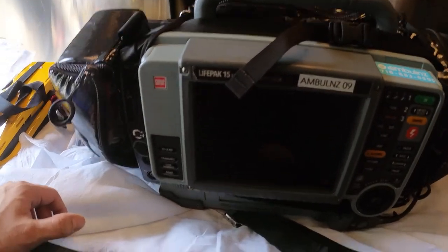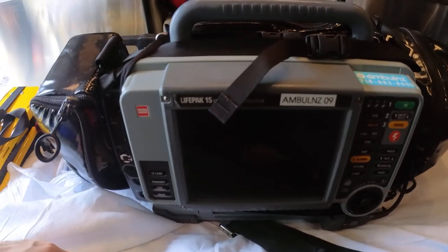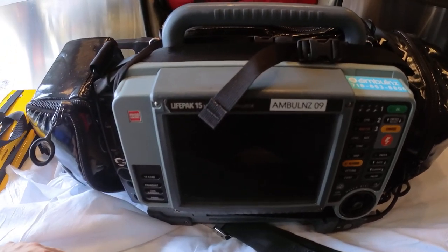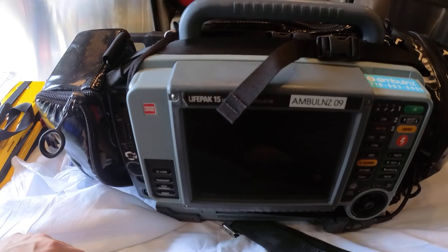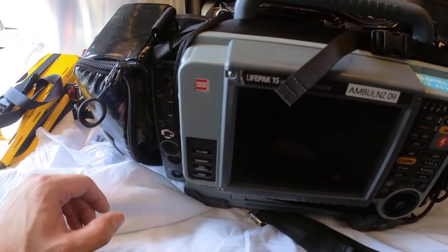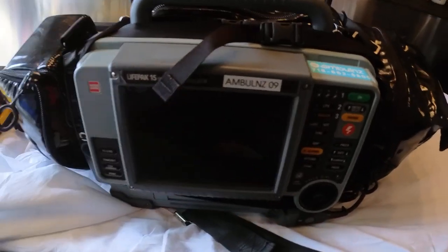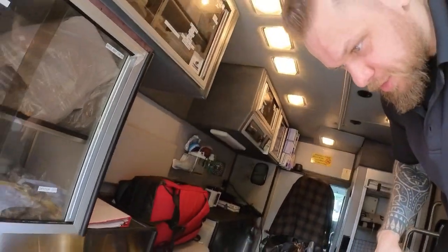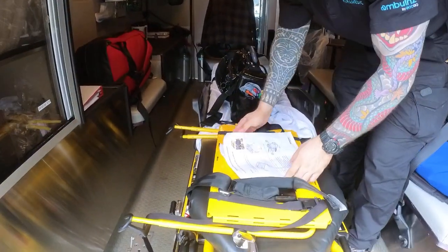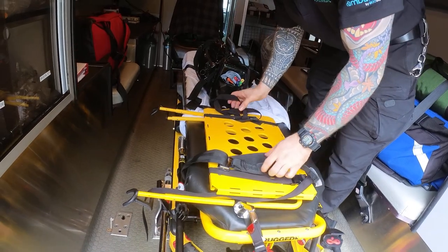Since the defibrillator platform is rated for 30 pounds and the assembly is 27.5 pounds, the only additional item I'll show you placing on it is the suction unit, in case you need suction for patients who have chest tubes. Now I'll show you how to mount it and how to make sure it's secure. I'll also show you how to mount the defibrillator on it.